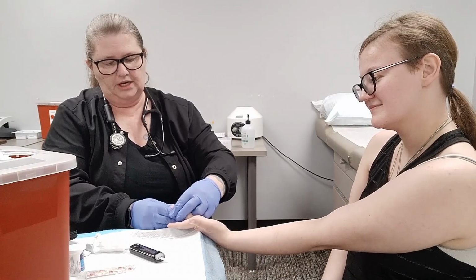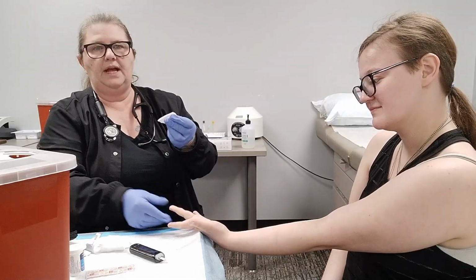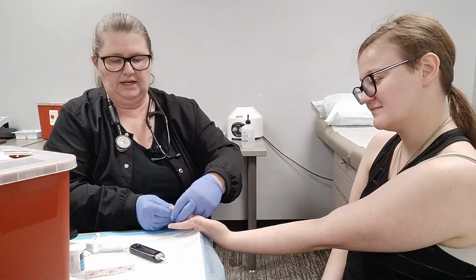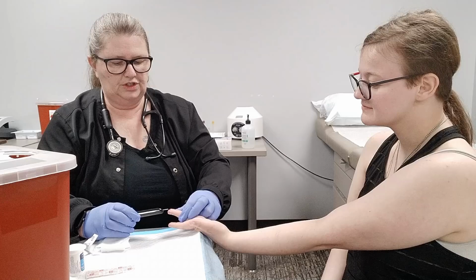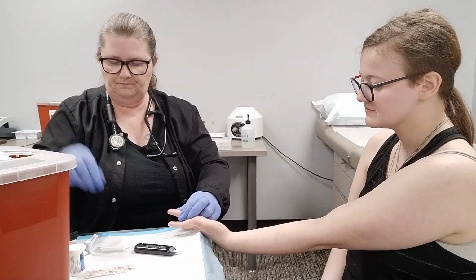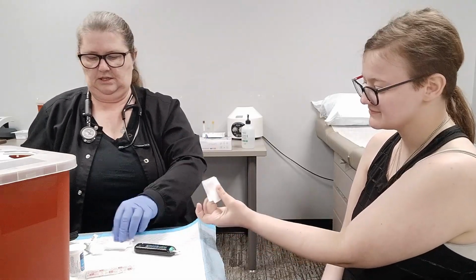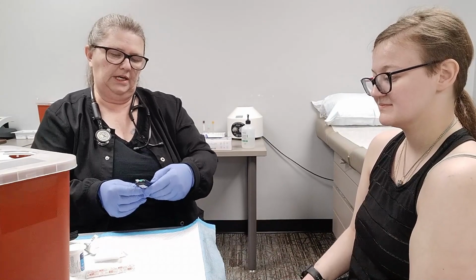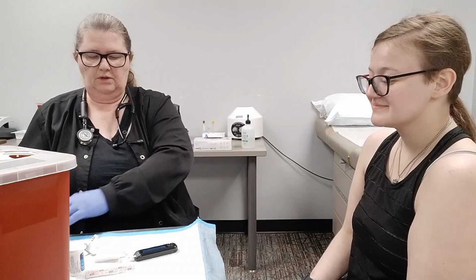Her hands are a little on the cold side, but this first drop of blood is primarily plasma. We're going to wipe that away, and then we're going to get a nice big drop of blood right there. Take the end of the strip, just touch it to that drop of blood, and it will just suck it right up, and give you a little beep, letting you know it's working. I'm going to have her hold pressure on that for just a little bit to get the bleeding to stop while we're waiting for the reading. And her reading is 91, which is very, very good. All right.